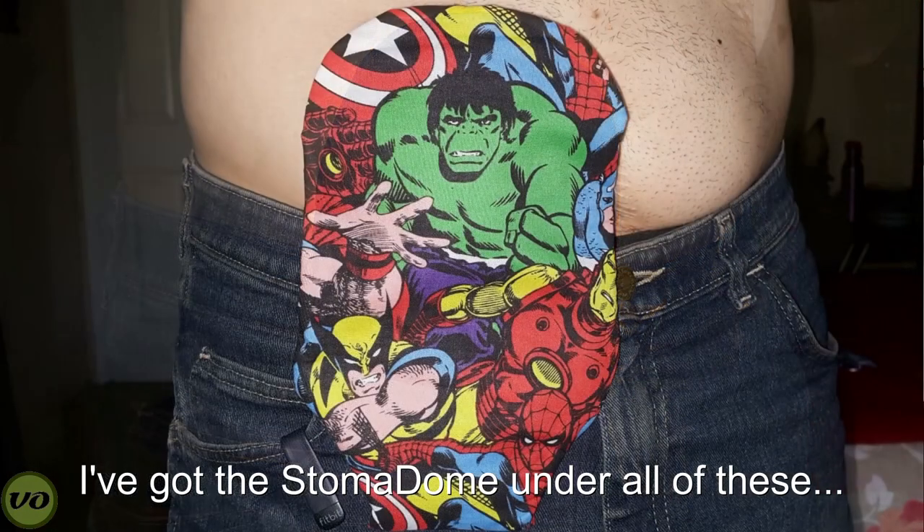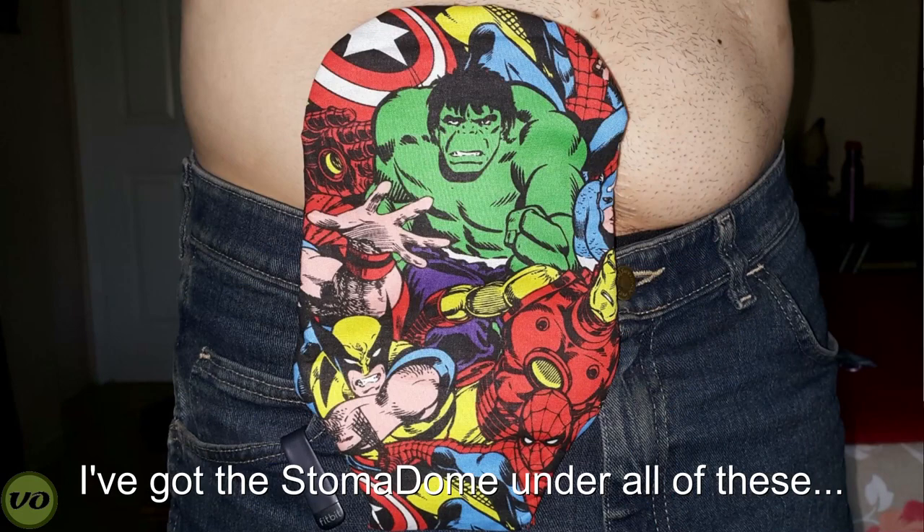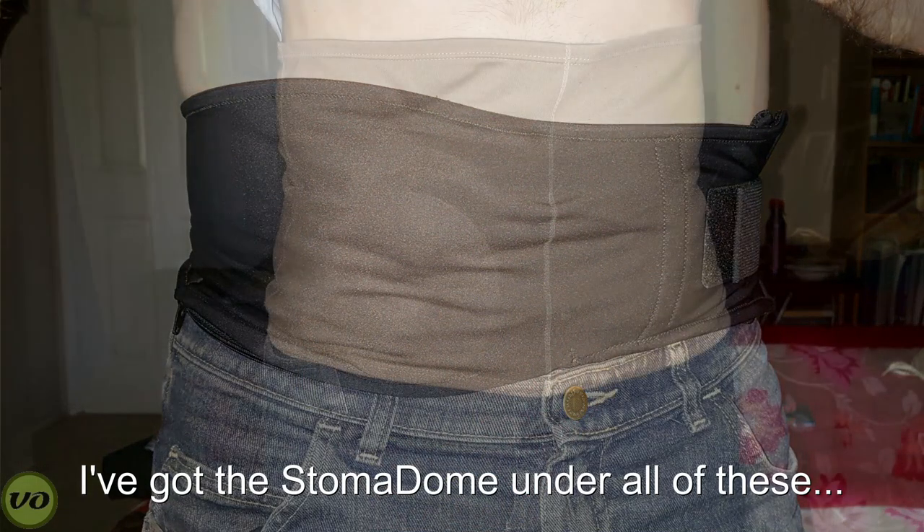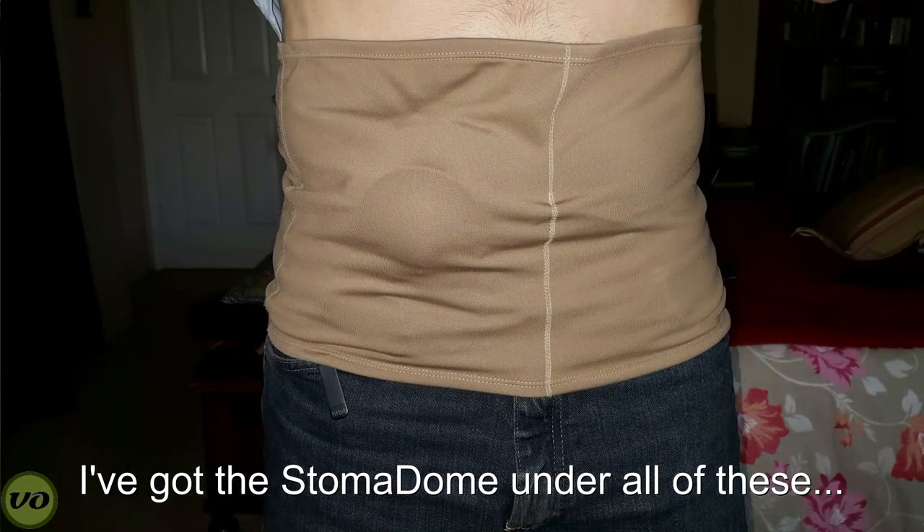Something that really needs to be mentioned as a huge bonus for this guard is the fact that I've been able to wear it with a pouch cover and also with a stealth belt. This is something I don't really see with any other guards, mostly because they're so big and bulky you couldn't fit them comfortably underneath these accessories. Stealth belt, ostomy wraps, pouch covers — no trouble at all. That's a huge plus.